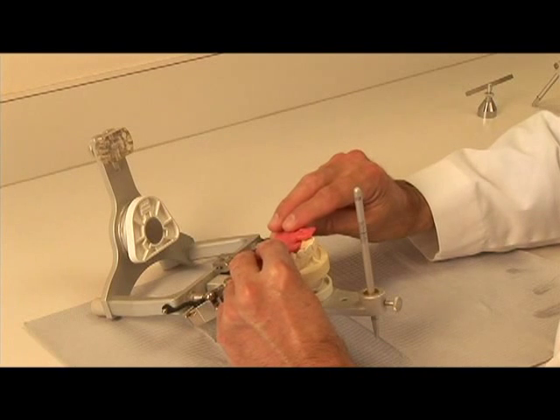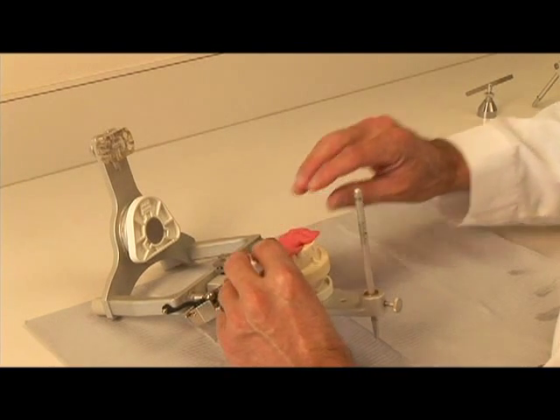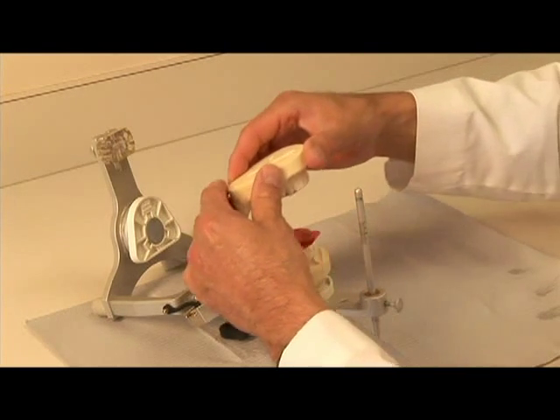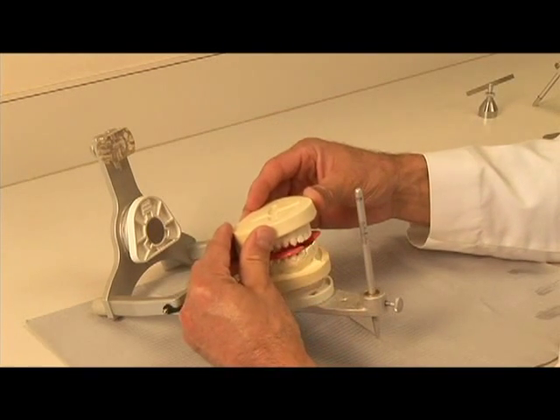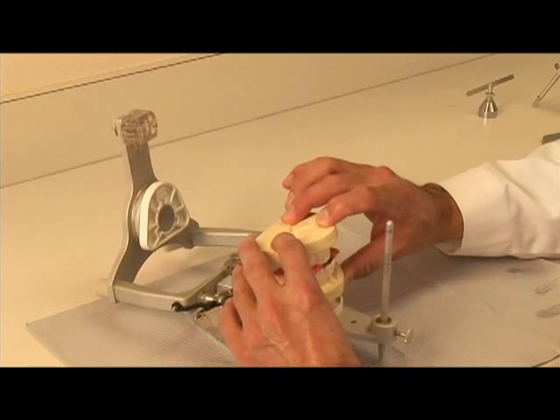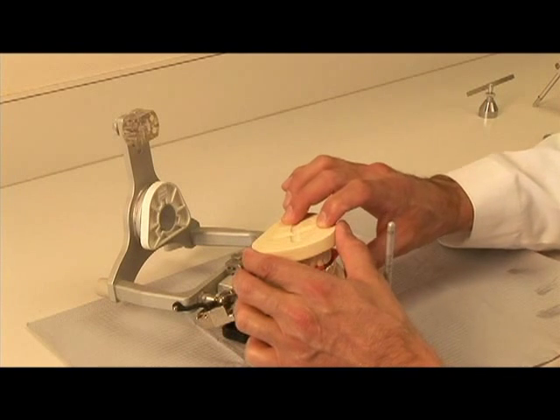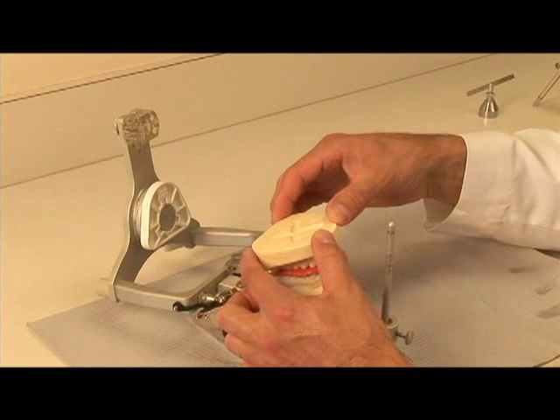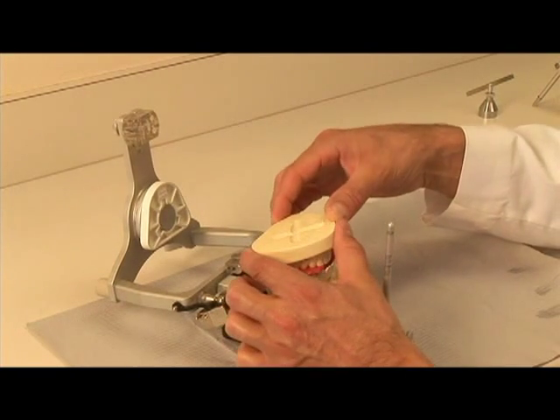Next, place the interocclusal record on the maxillary cast. Carefully position the mandibular cast on the wax interocclusal record. There should be a very positive seat between the cast and the wax interocclusal record. If in fact there is any distortion or rocking motion, the interocclusal record should be considered inaccurate and remade.